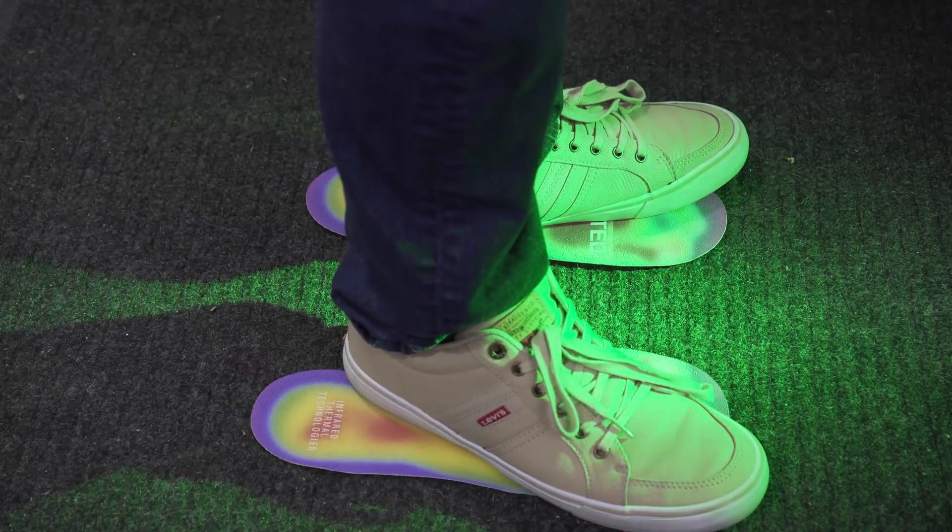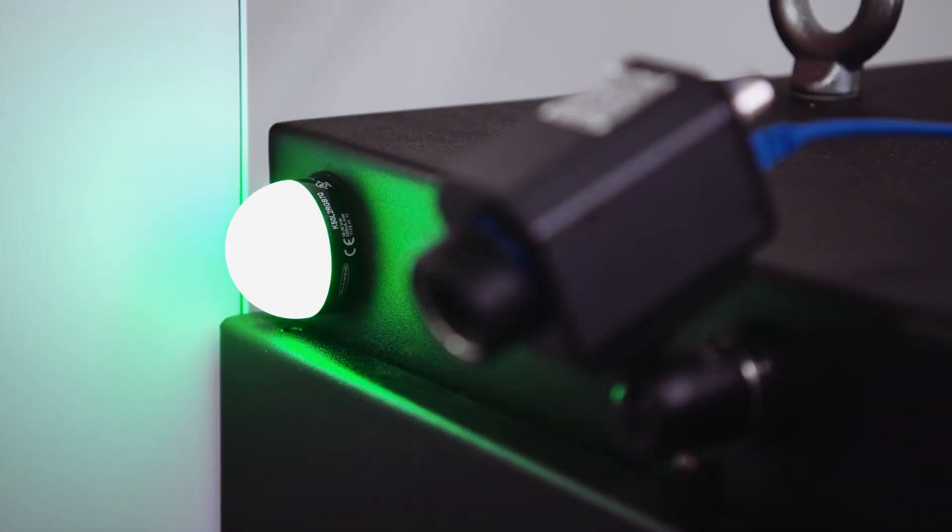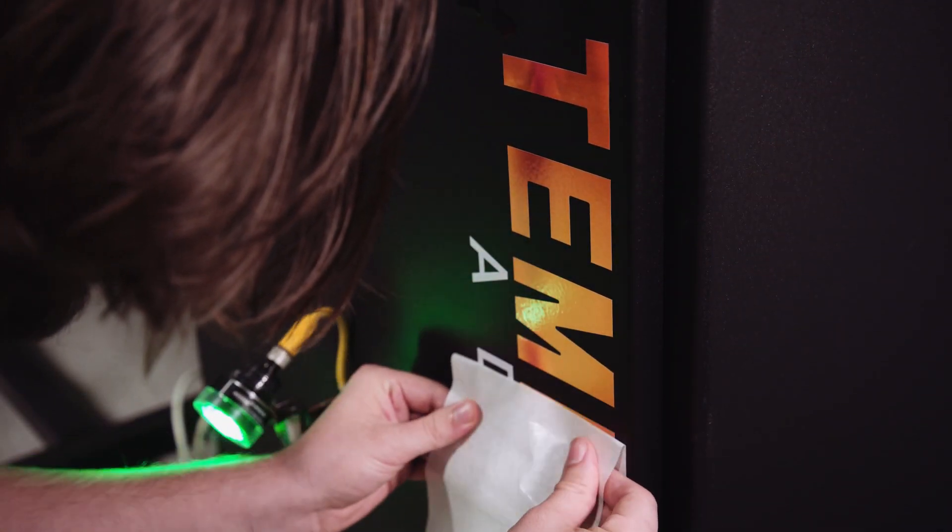Businesses all over America want to get back to work. The Emitted Energy Enlightened Temp Scan is here to help. We find ourselves in unprecedented times with this COVID-19 outbreak. The Enlightened Temp Scan unit was specially designed as a non-contact method to detect elevated body temperature utilizing infrared technology.